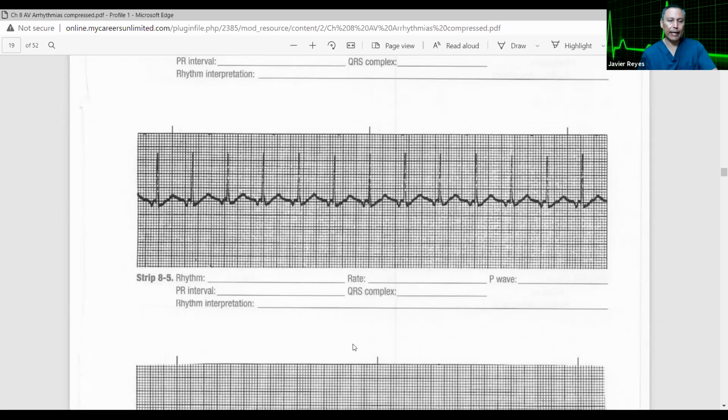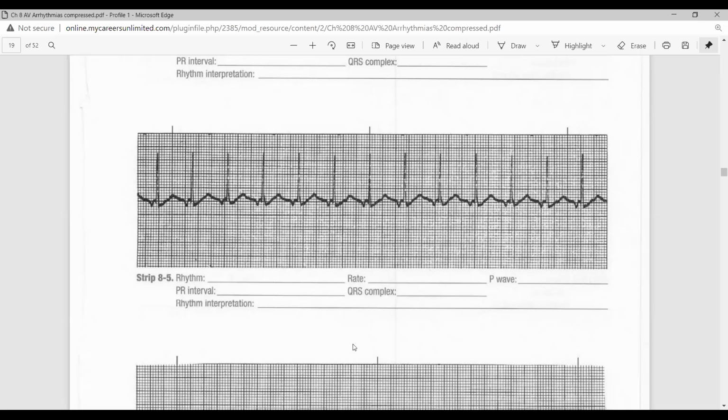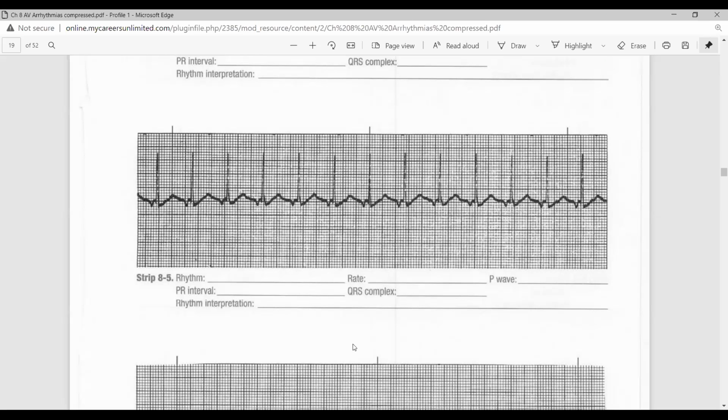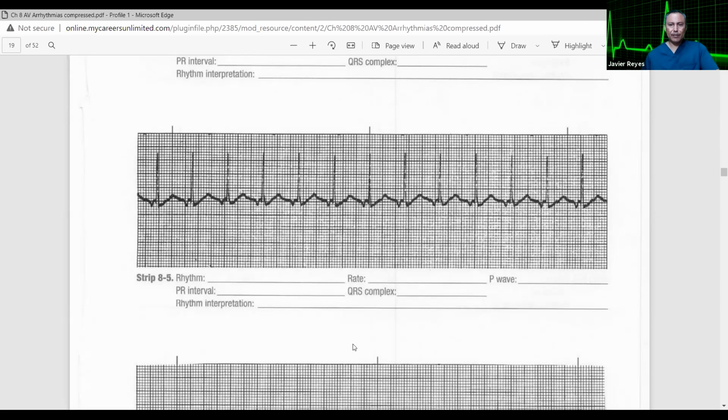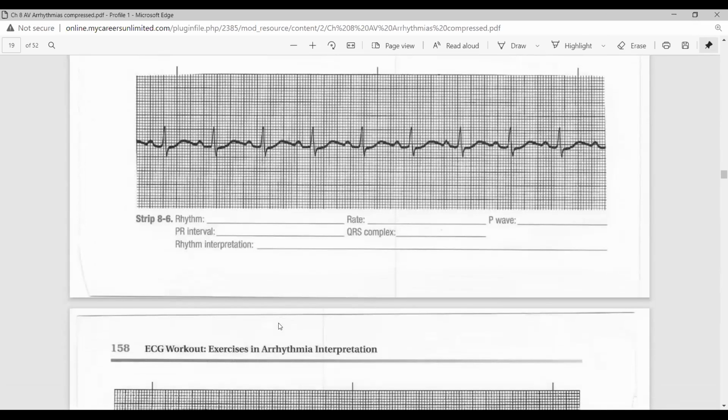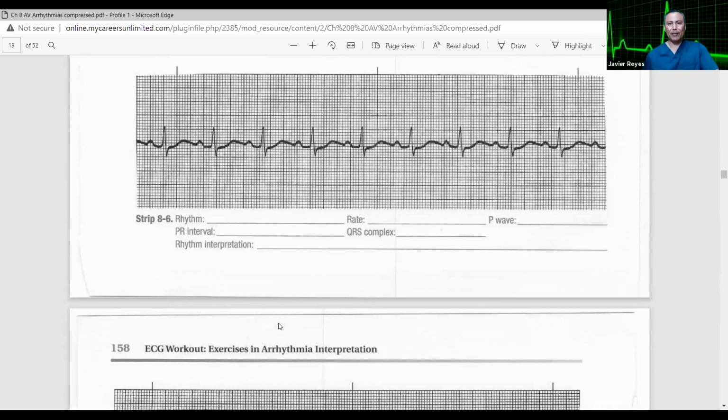Supraventricular, the rate is above 180, which is much faster. You can think of super like super fast. Okay, it helps you remember. Super fast or supra fast. It's a heart rate that comes from above the ventricles and is very fast, usually over 150 or 180. So this is just called a what? A junctional tachycardia. And how do you know it's a junctional? Because the P waves are inverted. Exactly. Very good. You are smart. Look at you. You feel smart now, huh? Yes. Now when you see Grey's Anatomy, now you know what they're talking about, right?